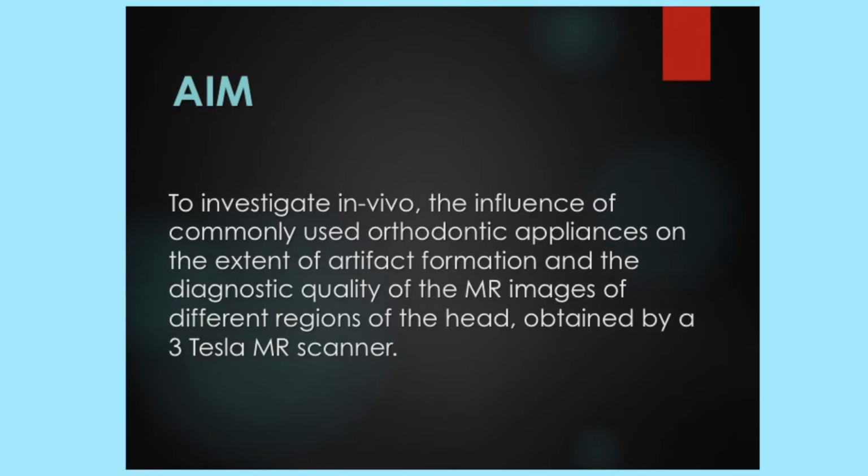These issues led to the aim of the study, which was to investigate in vivo the influence of commonly used orthodontic appliances on the extent of artifact formation and the diagnostic quality of the MR images of different regions of the head obtained by a 3 Tesla magnetic resonance scanner.